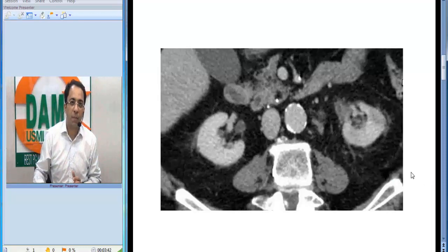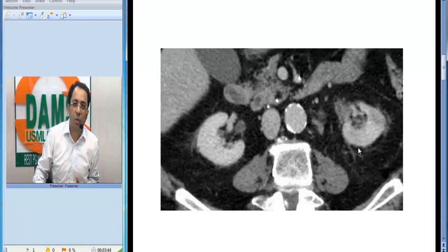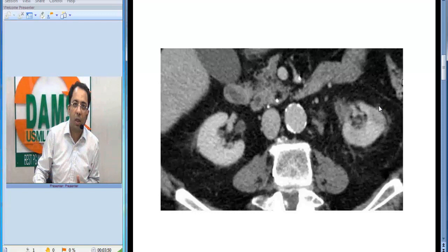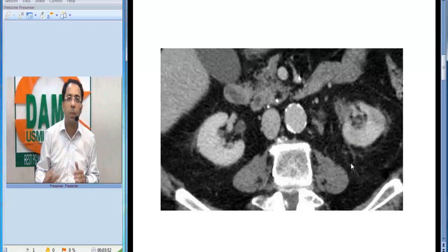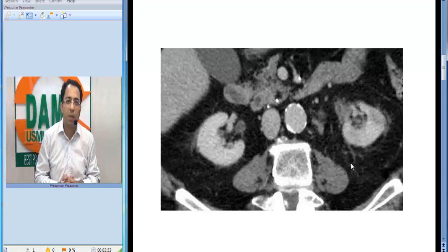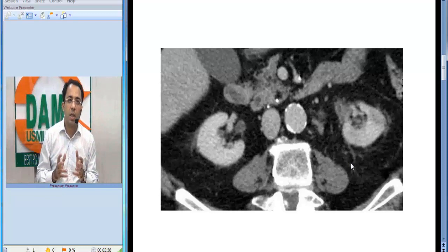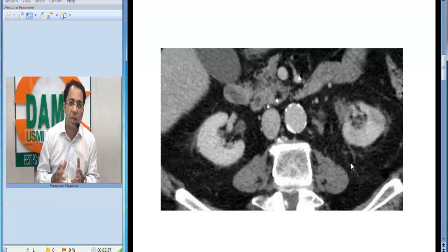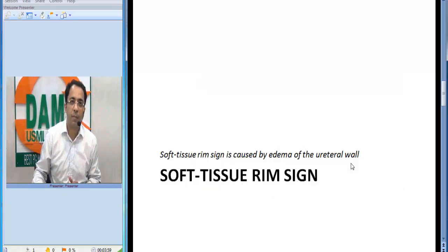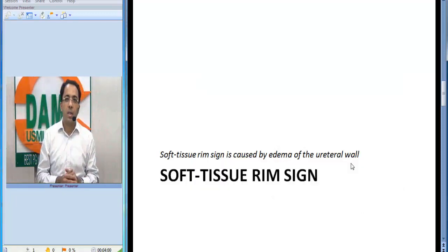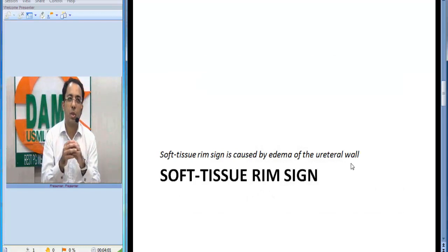Let me show you the sign. I want you to look at the kidneys and the surrounding area — can you see the surrounding area? You can see prominent perirenal septae. These are called cobwebs and are taken as a secondary sign of ureteric obstruction.